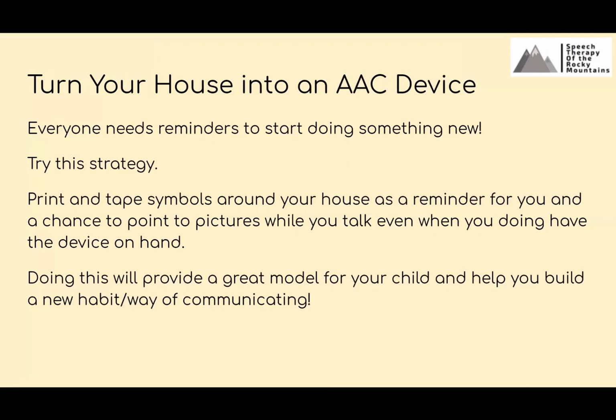And remember, for people who use communication devices, their communication is a combination of speech output and touching symbols. So that's what we're really trying to model here today, is touching buttons and either having them talk on the device or touching a picture symbol that's maybe on your wall or a piece of furniture in your house and then saying the word out loud, just as if a communication device was speaking that symbol.